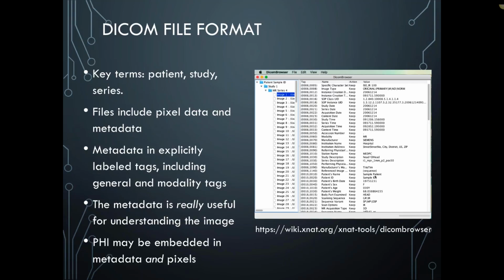And to make things more complicated, the patient identifying information is often included in fields that are not as obvious as patient name. But there's more subtle fields included that can be quite difficult to identify whether PHI is included or not. And to use the data in the research environment, a lot of effort has to go into identifying all of that lurking PHI.